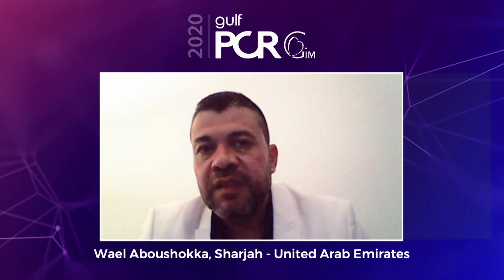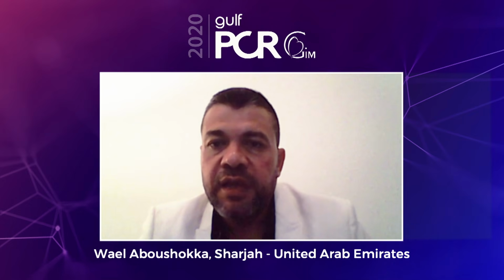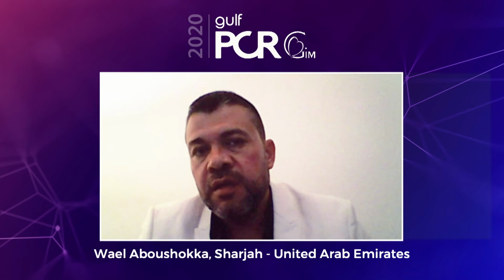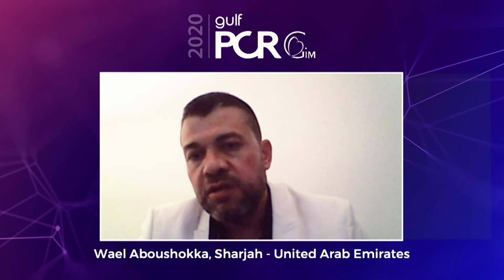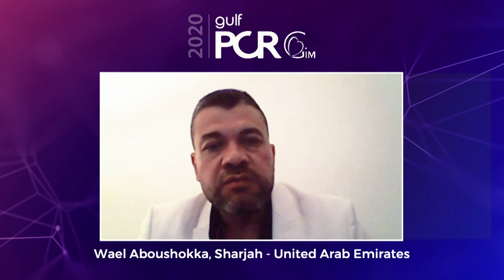Really, that is a very good question, and I'm happy that you asked me about it, because in the last few years, we are having more equipment and devices for management of calcific lesions. And for every case, you need to decide which device you will choose: Rota, orbital atherectomy, lithotripsy, shockwave. And I'm blessed that I work in a place where we have the whole setup, from balloons, cutting balloons, scoring balloons, to the lithotripsy.